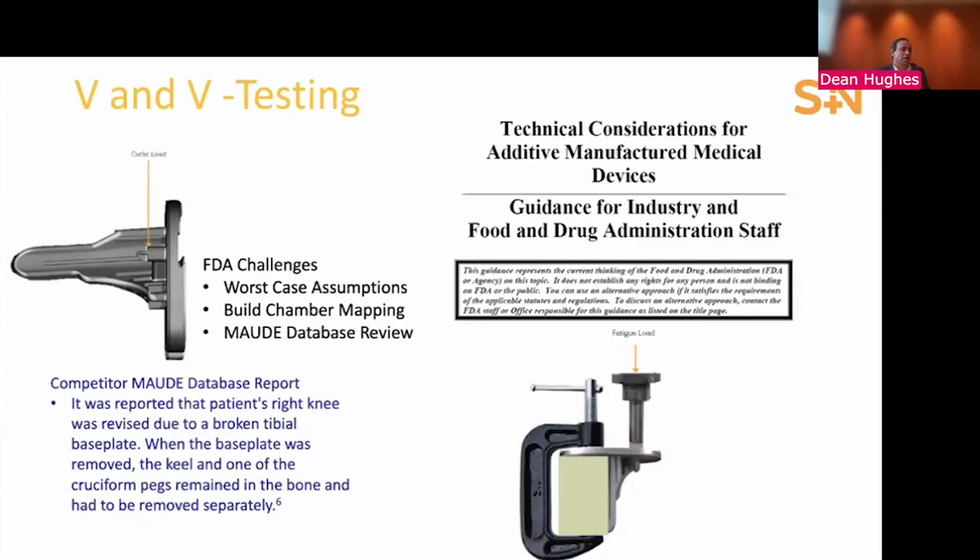So during our testing, as I said, we basically validated the fact that the base plate met the ASTM type standards. I will tell you that we had to go back and redesign some things to make it stronger. And we were able to do that in record time, because our management realized over the years we've been working with forgings and castings, we no longer have to do that. So the speed and the turnaround of the design is really nice from an engineering standpoint.